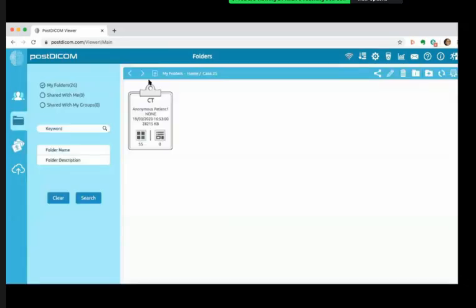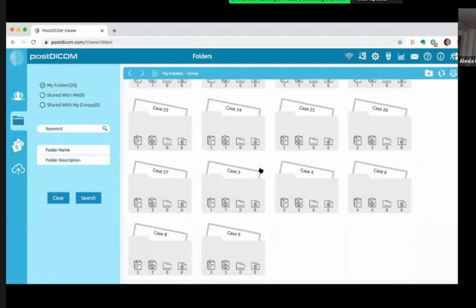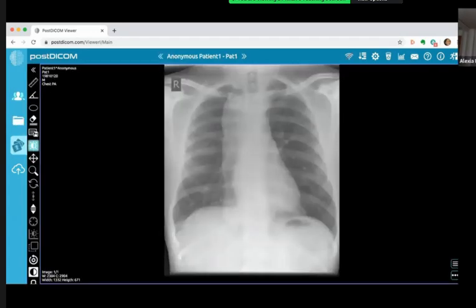Okay, so case 26. I will give you the history. It's a 39-year-old man who presented with dysphagia.